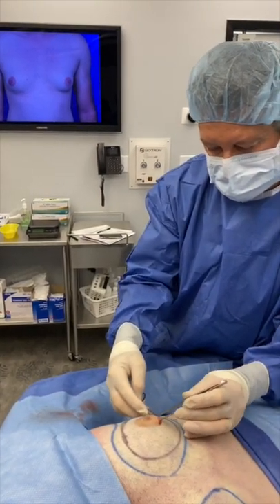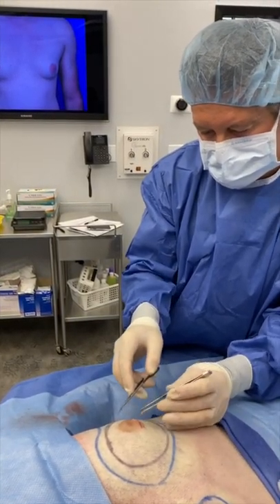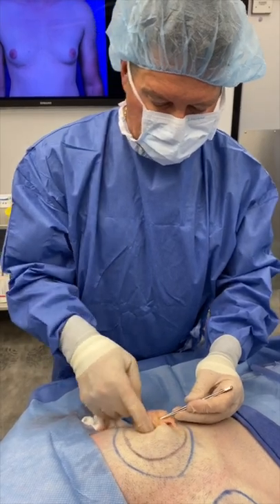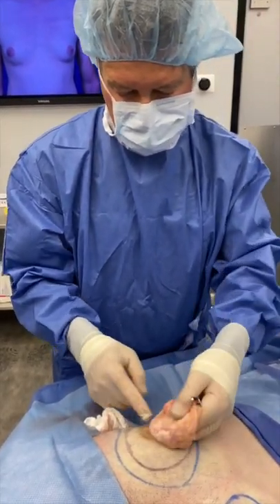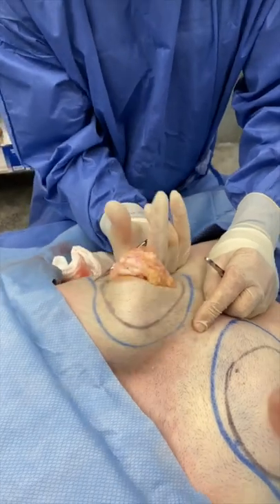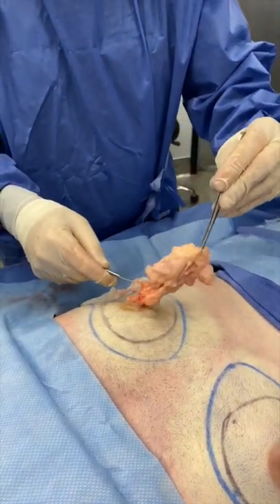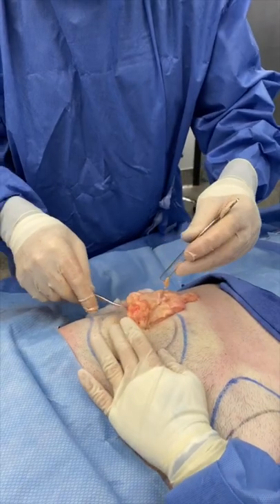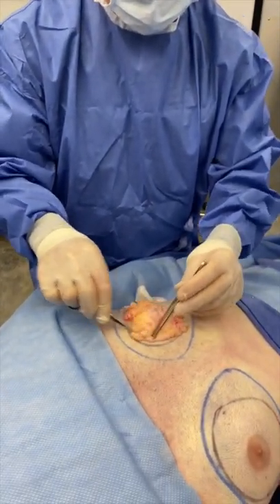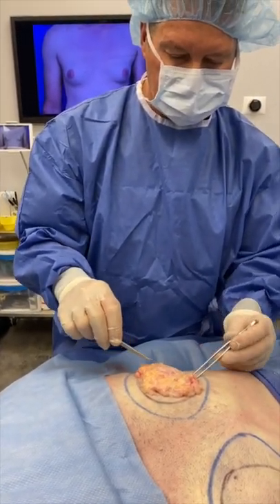It's a top-down approach, removing all the tissue from the subareolar region posteriorly. I'm working to remove the gynecomastia tissue, making sure I use scissor and finger dissection. Complete gynecomastia removal — you can see it conforms to the black marking I made earlier, and it's fibroglandular — a lot of glandular tissue here obviously.